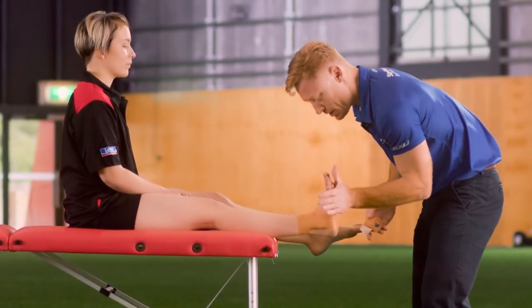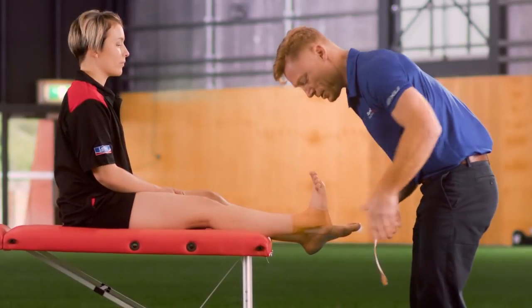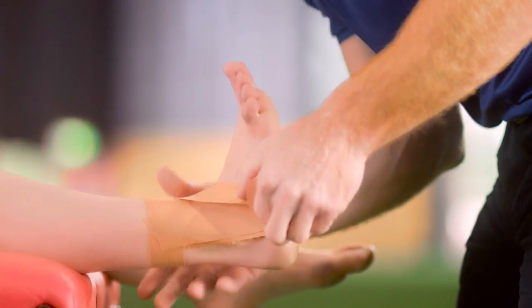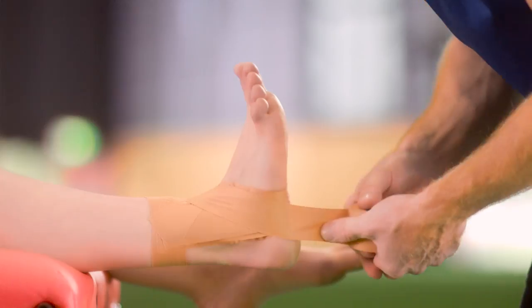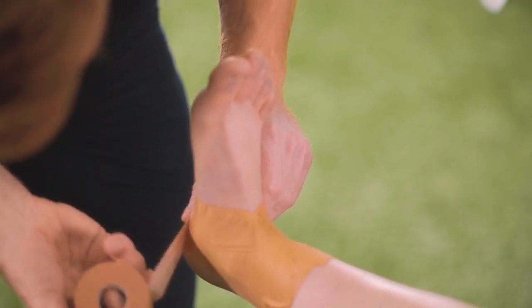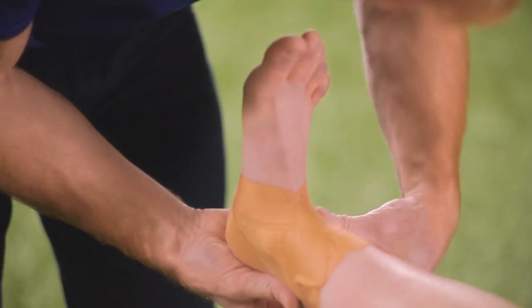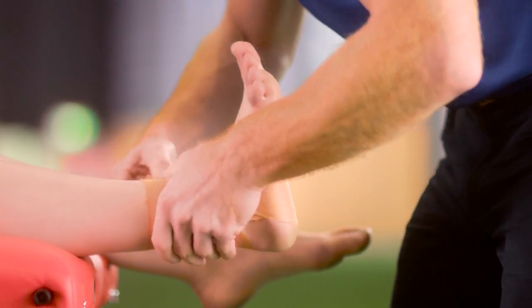In mild to moderate sprains, we can perform a heel lock as well. In the heel lock, we start on the medial or inside of the calf and ankle, come across the ankle, underneath following the tape line, to wrap around the heel, coming back across the front of the ankle again to the inside of the calf.